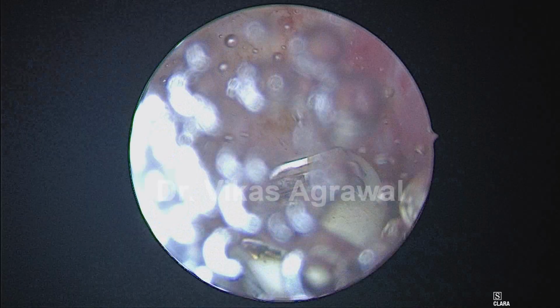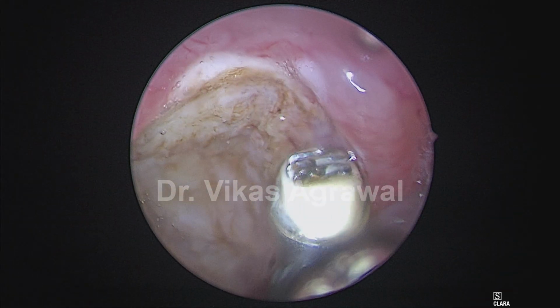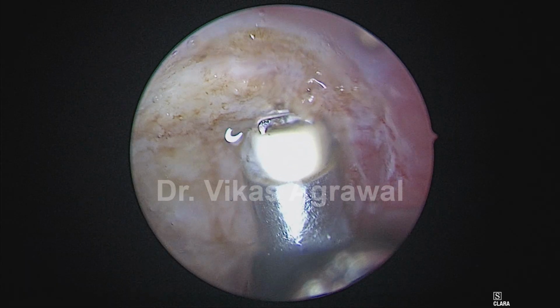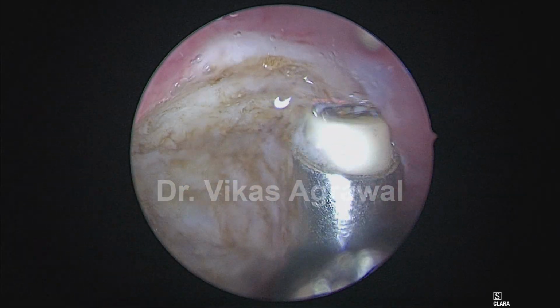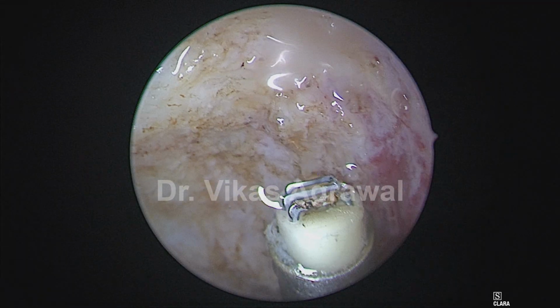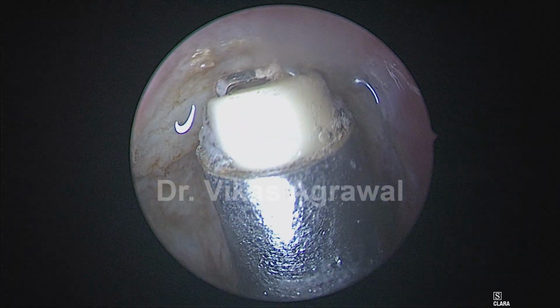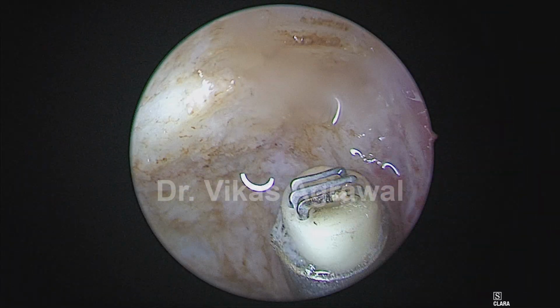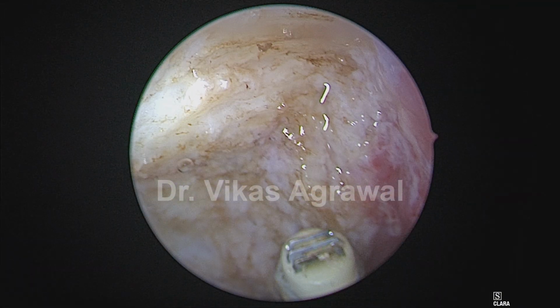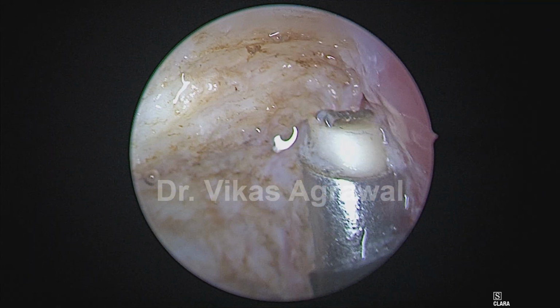So I will start again from the superior boundary. Superior boundary is the periosteum below the sphenoid bone. If I leave all these tissues, then they will tend to regrow. They will tend to give symptoms. I'll remove all these.